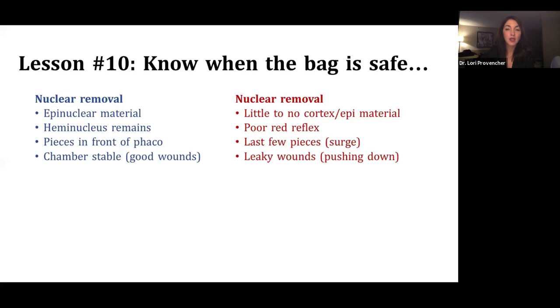I used to think that surge didn't exist, but I learned the hard way that it still does, even with excellent FACO technology that we have now. So when you have the last few pieces you're taking out of the nucleus, especially if they're very dense and you're getting a lot of occlusion bells, you need to be very careful for a surge. You'll never regret pausing, adding some viscoelastic behind those last few pieces to push the bag back, and then taking your nuclear pieces out. If you have leaky wounds and you're noticing that, that's a less stable chamber, and so you need to keep that in mind throughout the entire case.